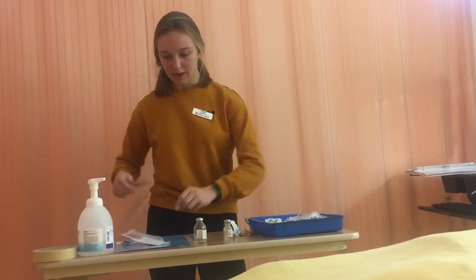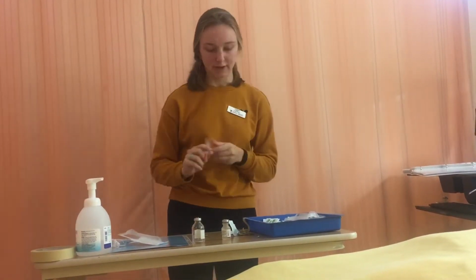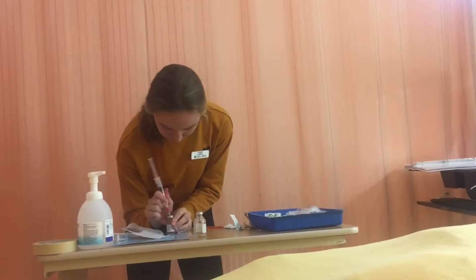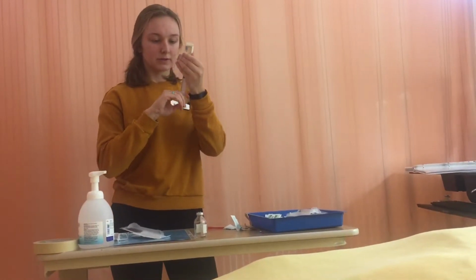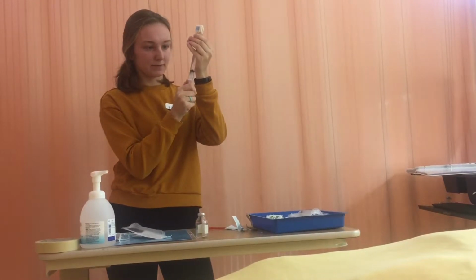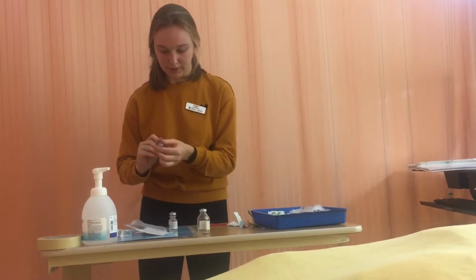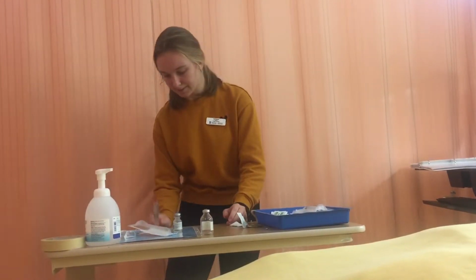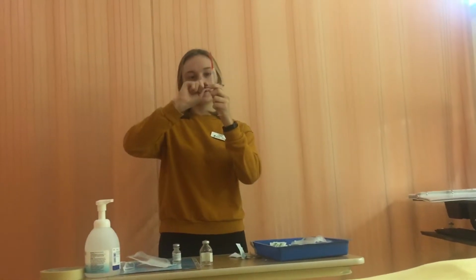to the top. And I'm going to draw back to 8.2 milliliters of air just so the pressure in the vial is maintained. And I'm going to inject the air and draw back the fluid. So I'm going to make sure all the air is injected. And I draw back the full amount of fluid. I'm going to remove this. And I'm going to use the scoop method to pick up the cap. And I'm going to tap out the bubbles just to make sure that we're instilling the right amount of sterile water.